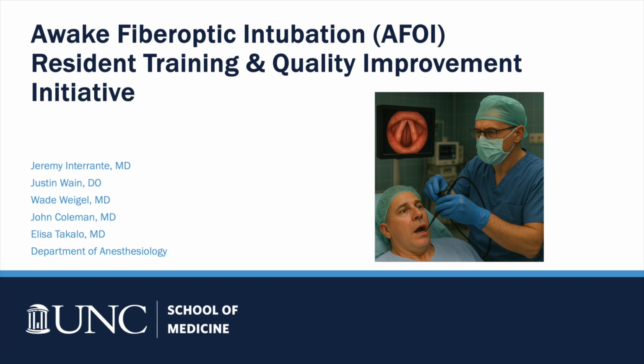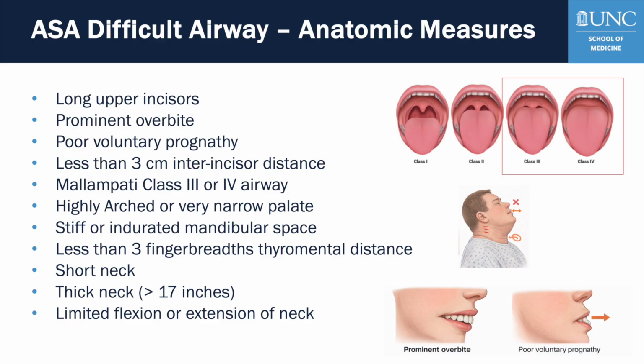Welcome to this training video on awake fiberoptic intubation, an essential skill for managing the anticipated difficult airway. This module is designed to improve confidence, understanding, and performance among anesthesiology residents. When we talk about a difficult airway, we're talking about any situation where mask ventilation, supraglottic airway ventilation, or tracheal intubation may be difficult, alone or in combination.